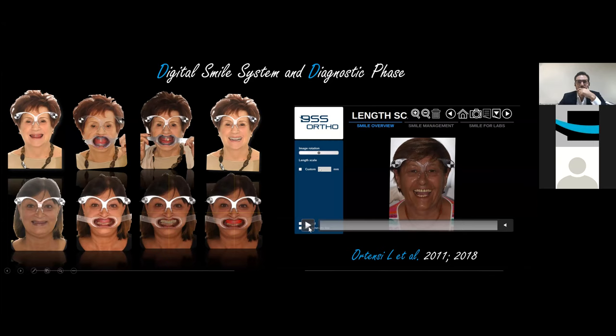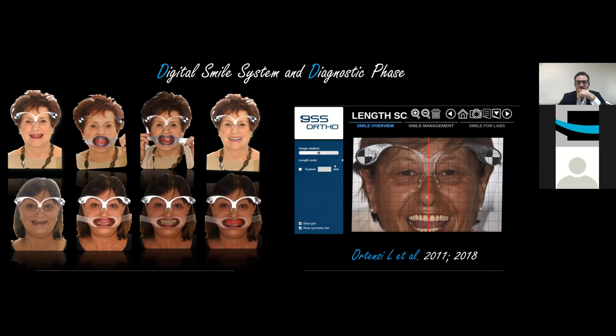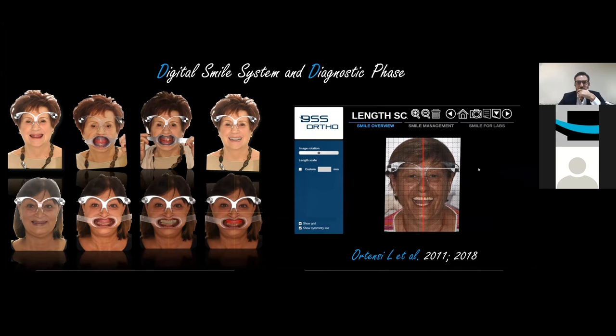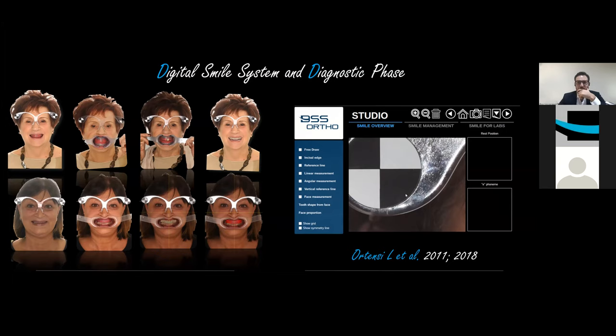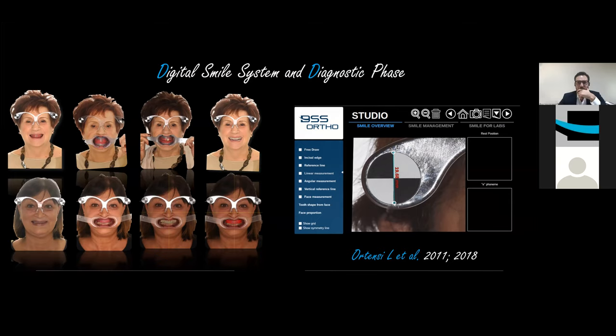After I take two images, I put these images inside a 2D software, Digital Smile System. I use it because I want to share with the patient immediately information about the future of his smile. But I don't want only to talk with the patient. I want to have information data for my new therapy. I want to prepare a plan of treatment, so I can do that with this software.